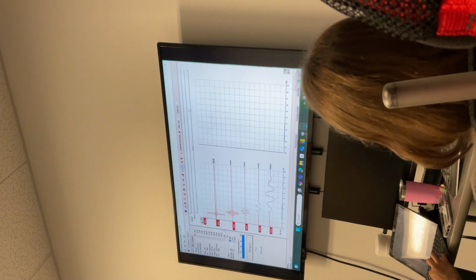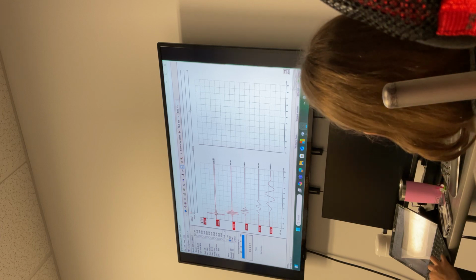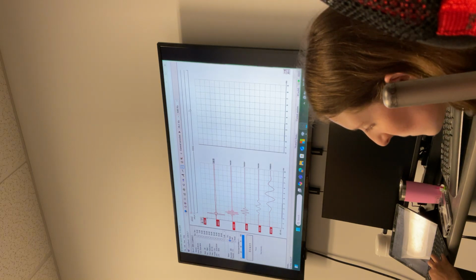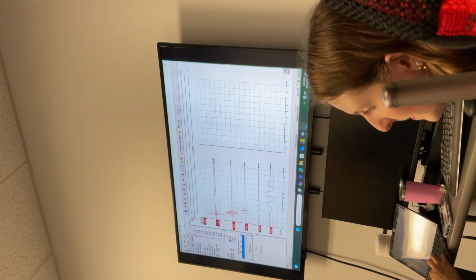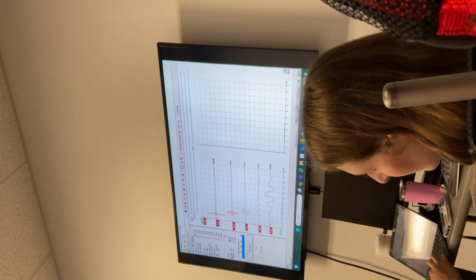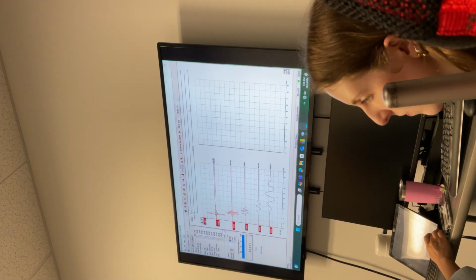So, to visualize, you're playing the sound through the inserts. You want to know what stimulus you're playing. One of the ways you can do that with electrophysiological equipment is by using this loop back. That also can be used for troubleshooting sometimes.